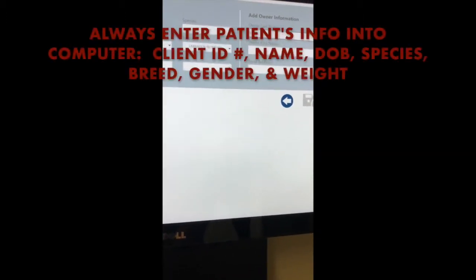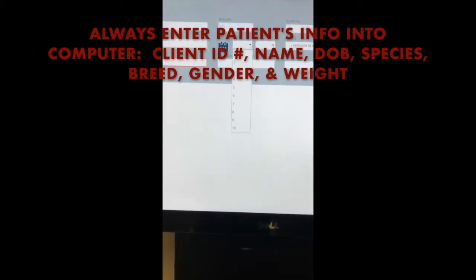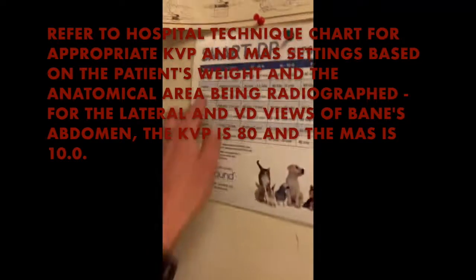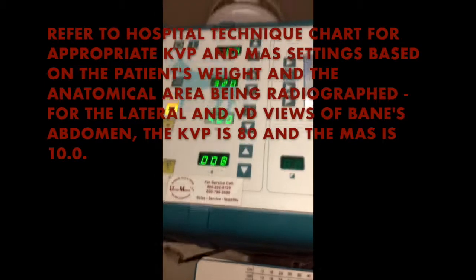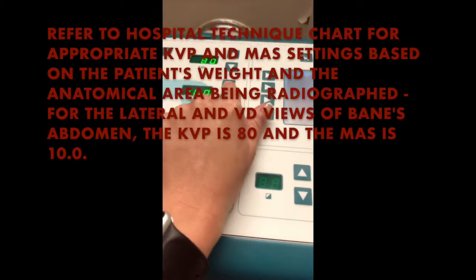Survey radiographs obtained prior to the contrast study help determine proper exposure and patient prep, and may also potentially eliminate the need for contrast media altogether. The vet will select the contrast agent based on the patient's tolerability for fasting and sedation, the suspected problem indicated by the survey radiographs, the uses of the various contrast agents, and indications, contraindications, and side effects.